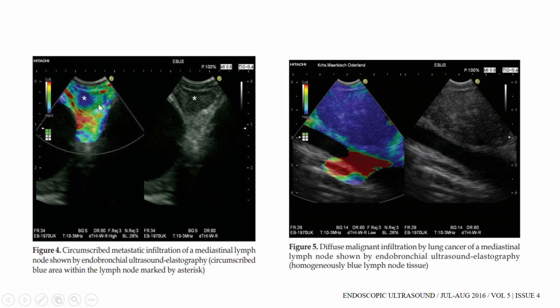So this is why we generally use an elastography in routine clinical practice, but the mere presence of a stiffer node or a less stiff node will not confirm whether it is malignant or benign. You need a tissue confirmation, and this can just guide us in understanding what sort of node we are dealing with and how we are going to triage our samples and choose the target site of the node for FNAC.